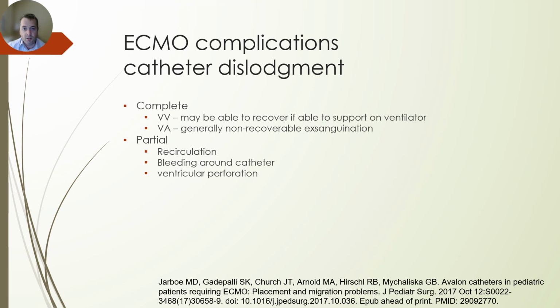Catheter dislodgement. Hopefully this doesn't happen to you, because if it does, it can be very hard to recover from. VV may be possible if you're able to adequately support on the ventilator, but VA, which I did see once, results usually in non-recoverable exsanguination. The vessel tends to retract and it becomes very difficult to re-establish ECMO support before the patient dies from blood loss.